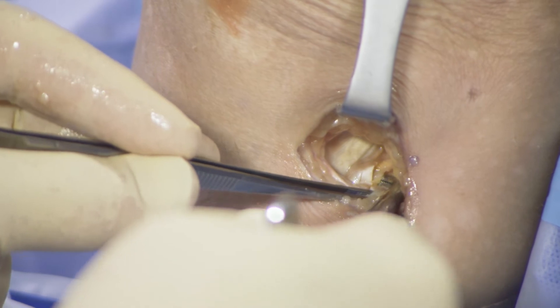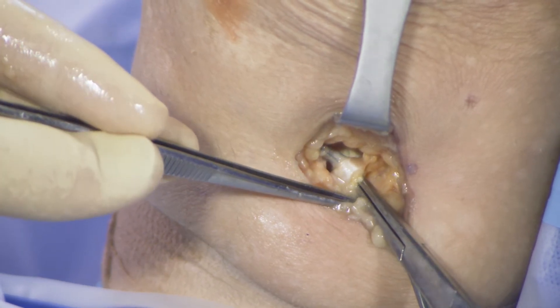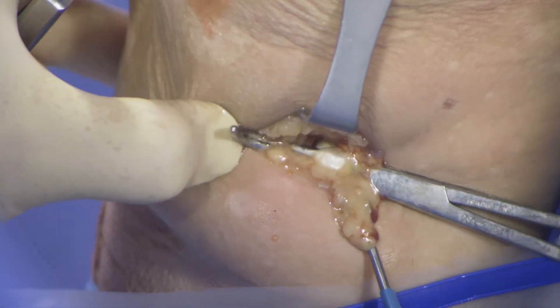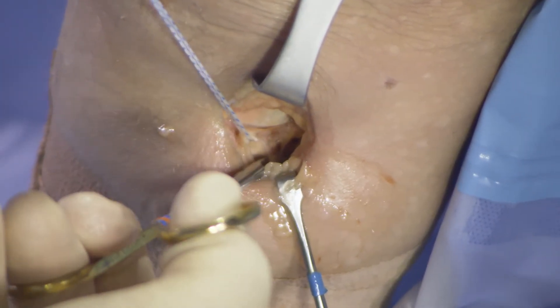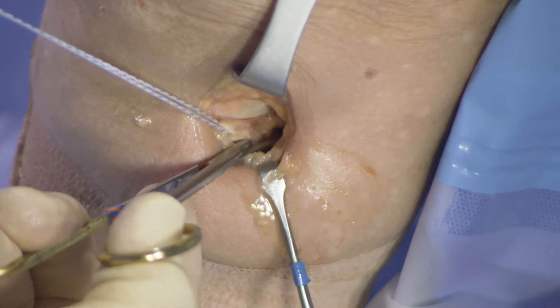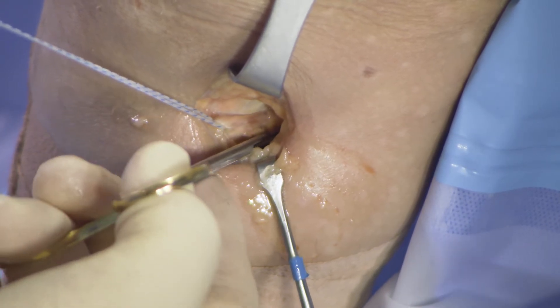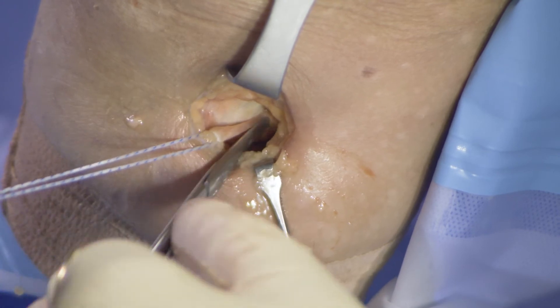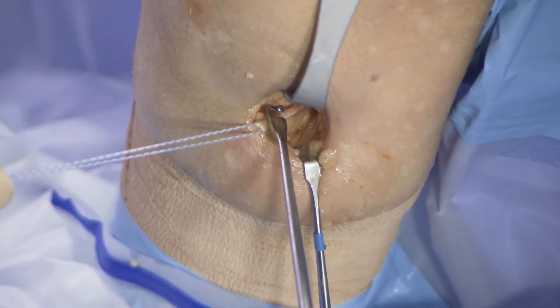On the inside of layer one you'll find the hamstring tendons. The gracilis will be the first. The semitendinosus is the second tendon, and using a right angle clamp, the semitendinosus tendon can be hooked. Typically I would place a Penrose drain beneath the semitendinosus tendon, allowing you to pull it forward into the wound. Once that is done, we look for the fibrous attachment to the medial gastroc, and those are cut using Metzenbaum scissors facing away from the tendon. Once those are cut, the tendon will typically retract further into the wound, and there will be more mobility. I then run my finger along the top and lower surfaces of the tendon and make sure there are no other adhesions or obstacles to passing the tendon.